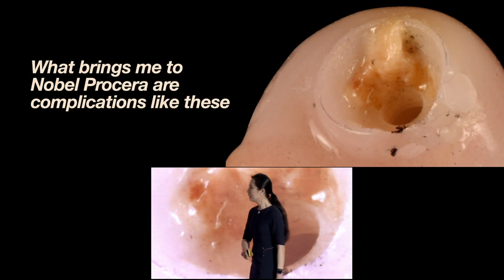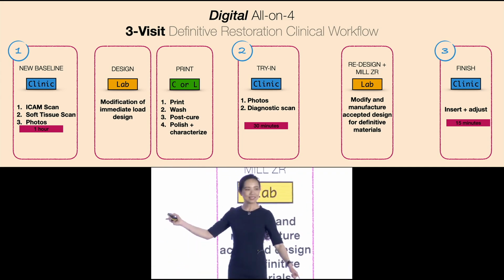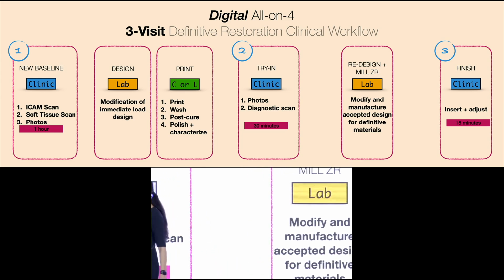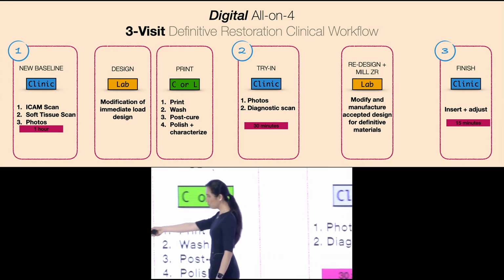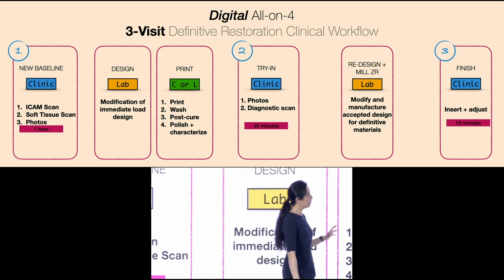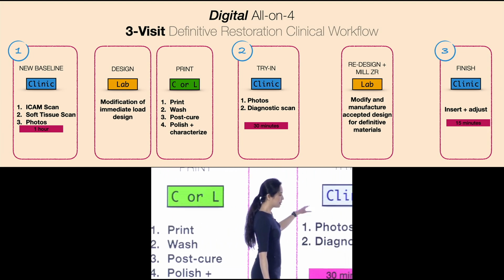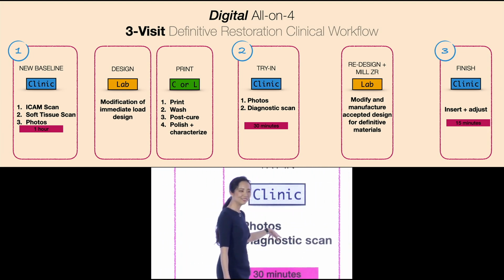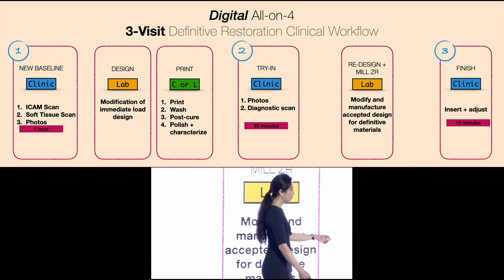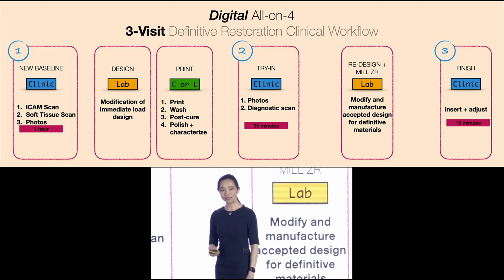Oh, sorry. So what happens is that if you look at the actual clinic flow, it doesn't take much from start to finish. Still, the longest time you're going to take is at the beginning, where you're talking to the patient about what changes they want to make. And from there, all this is passive. The next time you see them, the restoration will drop right in, because there shouldn't be any real adjustments. And assuming that they're happy, the final zirconia only takes 15 minutes, because everything's dialed in again.